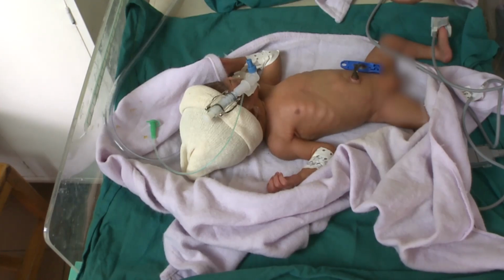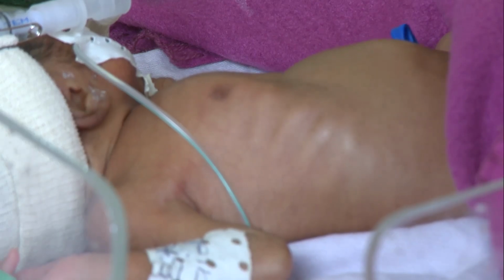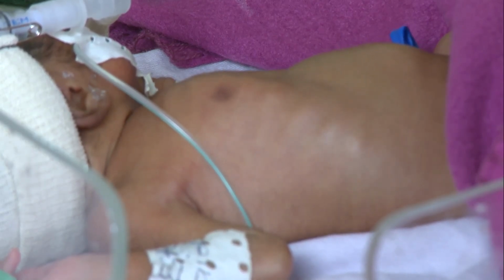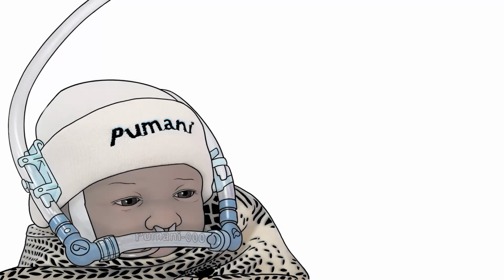The first is that their oxygen saturation levels may be low. The second is that they may show increased work of breathing. CPAP treats both of these by using a combination of oxygen with gentle continuous pressure. Your first priority will be to quickly improve the low oxygen saturation. Improving the work of breathing is likely to take much longer.